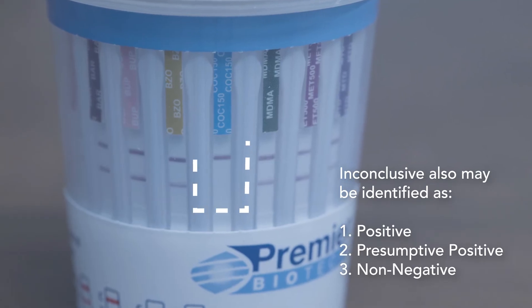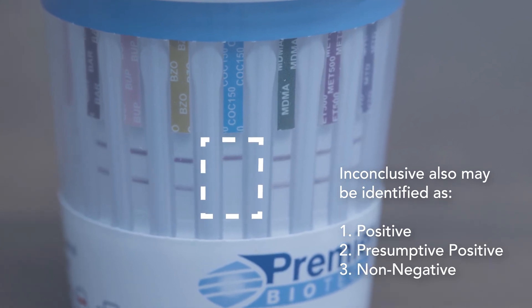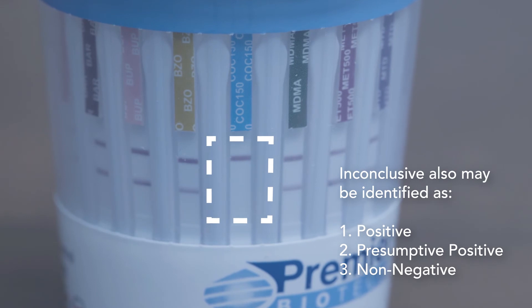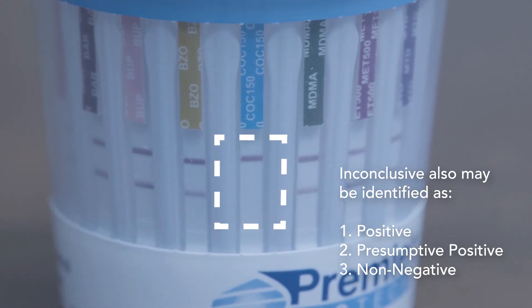An inconclusive result, as seen in this example, is indicated by only the top control line present and the absence of a bottom test line, read at five minutes. The Premiere BioCup may come with specimen validity testing.